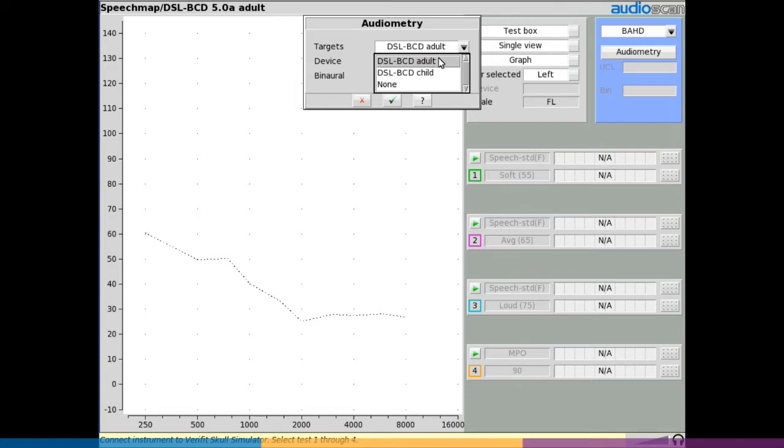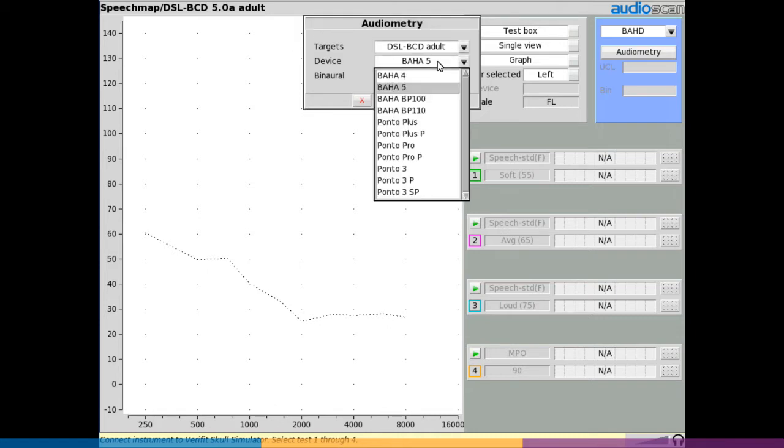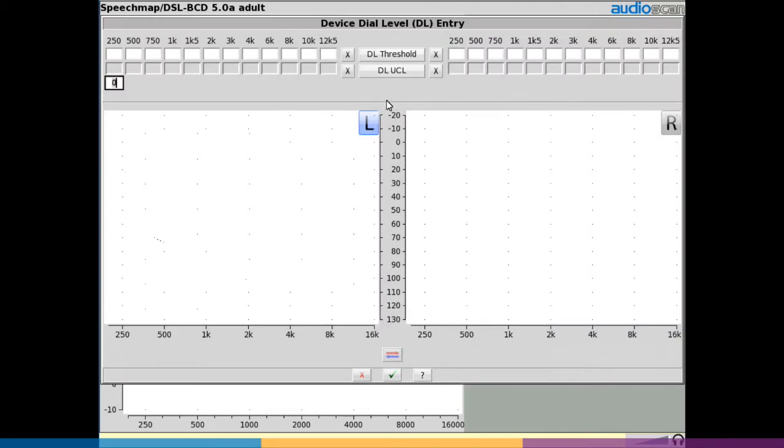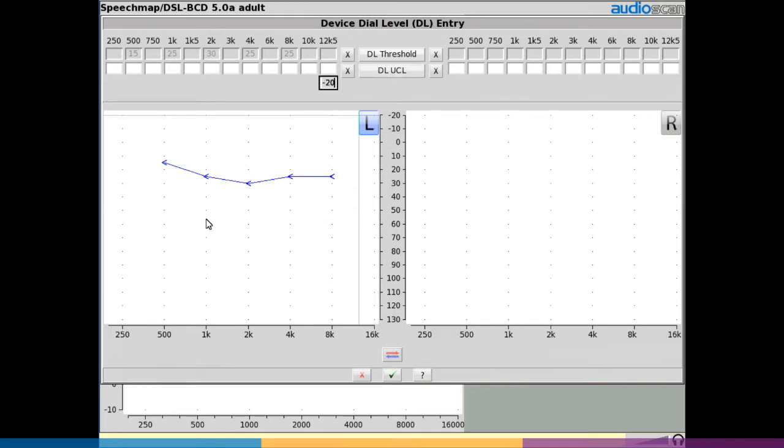Select the desired fitting rule: DSL-BCD adult, DSL-BCD child, or none. Select the device to be verified from the drop-down device list, then select yes or no for binaural summation correction — note this is only available for the adult formula. Select continue, then enter the dial level thresholds and dial level UCLs if measured by clicking on the graph. Note that dial level values are obtained from abutment-based BAHD generated audiometry in the manufacturer's fitting software.